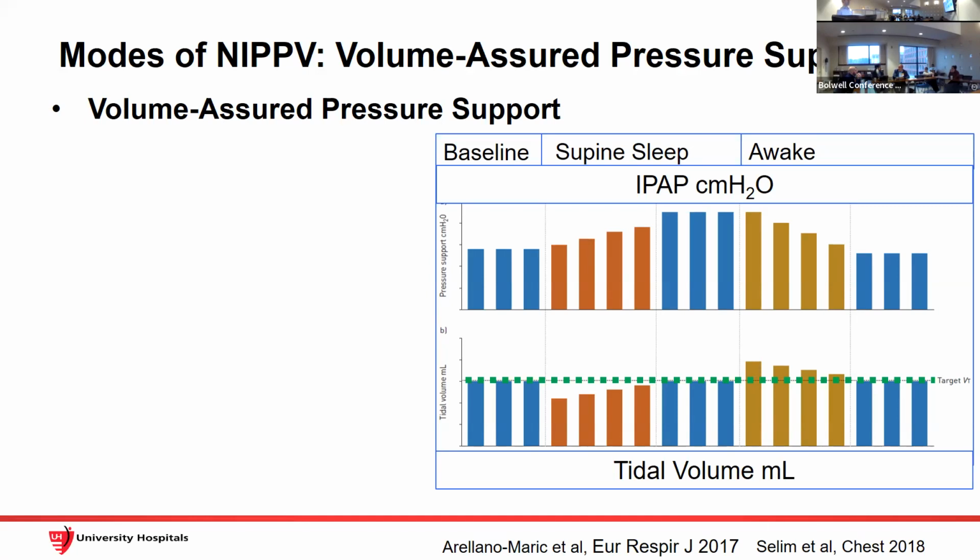And then comes along bi-level PAP. Now remember, that's a flow device. It's not a pressure or volume. Now you can say, well, volume gives you flow and flow gives you pressure, and this 3-dimensional business was in there. But I was involved in a patent fight between Respironics and a surrogate of ResMed in the early 90s, in which they tried to say, well, BiPAP is just double PAP, right? You've got one pressure of PAP, and you've got another pressure of PAP, and you go from that point to that point, right? That's all you do.